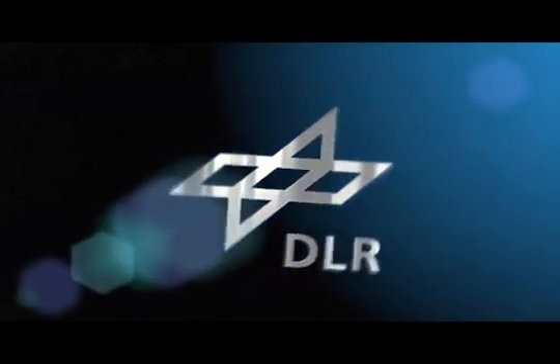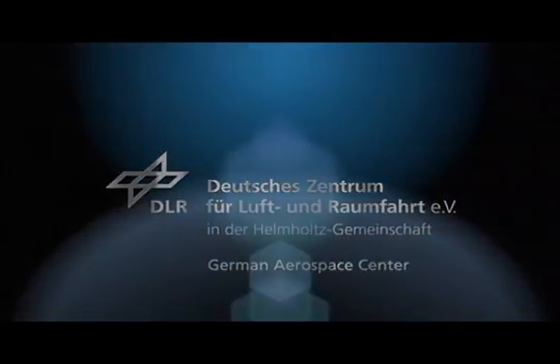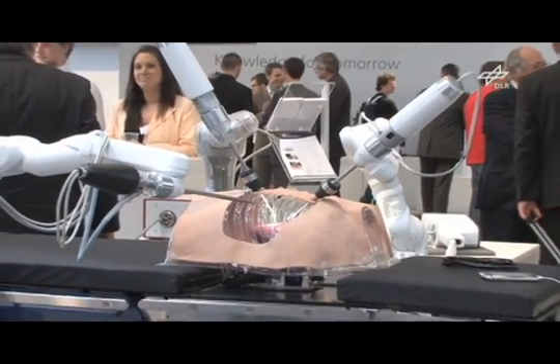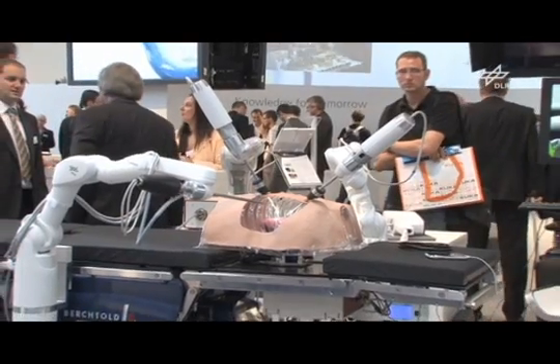Welcome to the DLR webcast. This is our robotic system MiroSurge, as it will be used in future surgery. The goal is to operate on the patient as gently and precisely as possible.